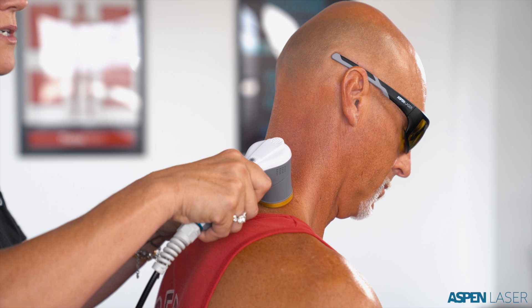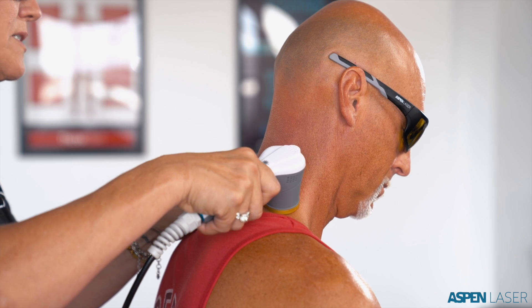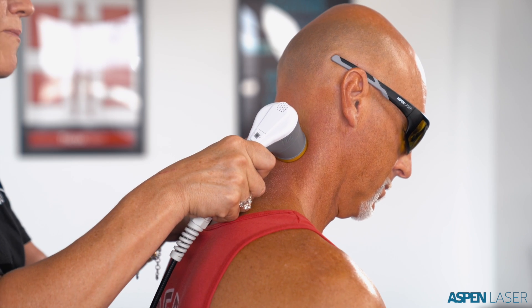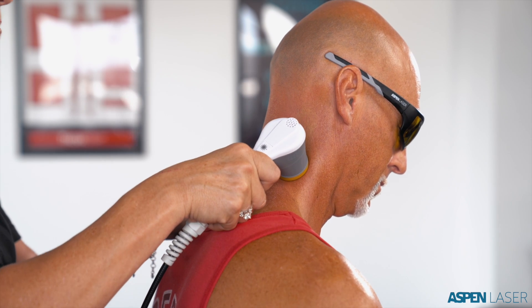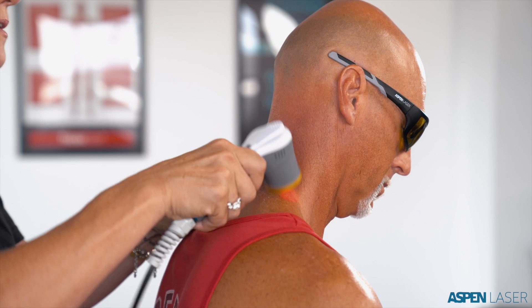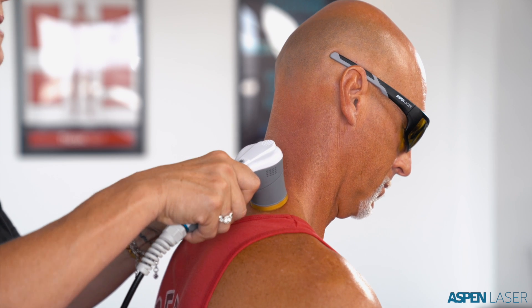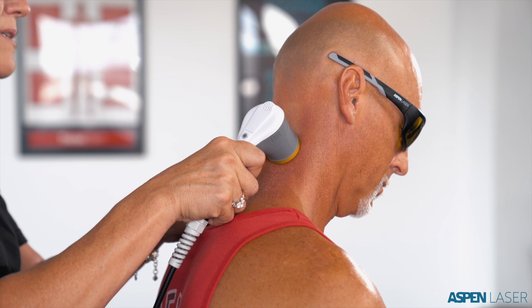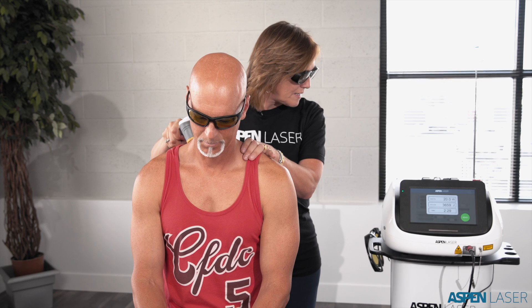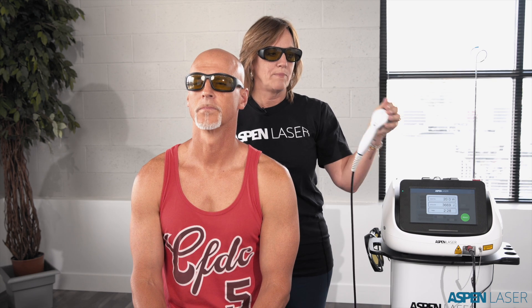With about 30 seconds to go, I check in with the client and ask if it still feels comfortable, if there's any discomfort at all. If the person had dark hair or dark skin, I might have to move slightly faster than with a lighter-skinned person. In the hairline, because light is picked up by color, it can feel prickly and I may need to go a bit faster. At two and a half minutes, I pause by clicking the button once, put the handpiece in the palm of my non-dominant hand, and begin to retest range of motion.